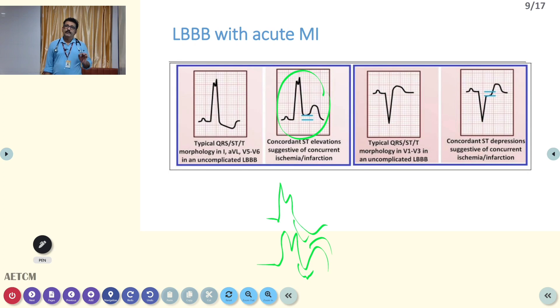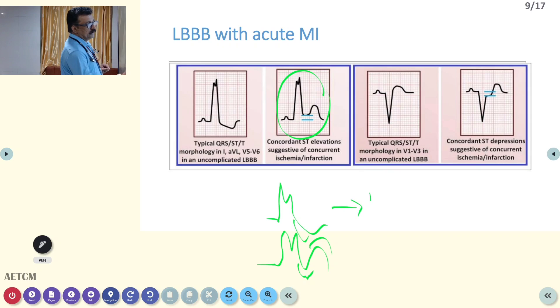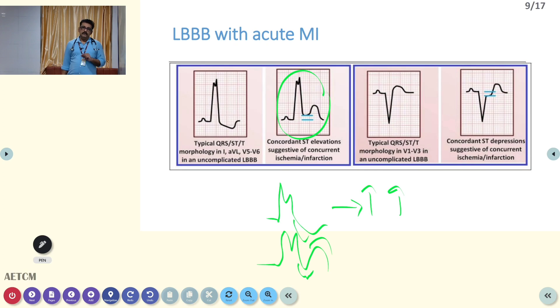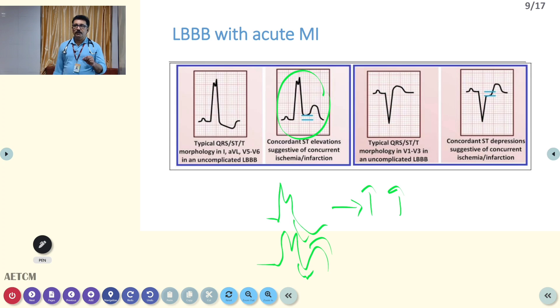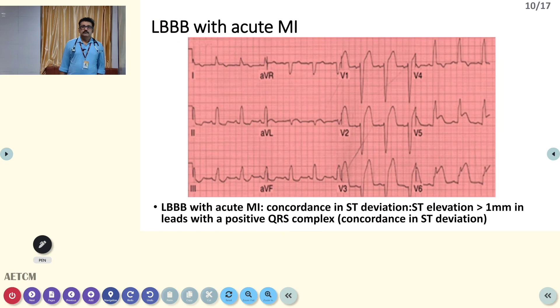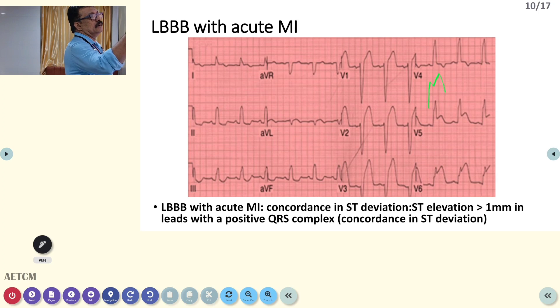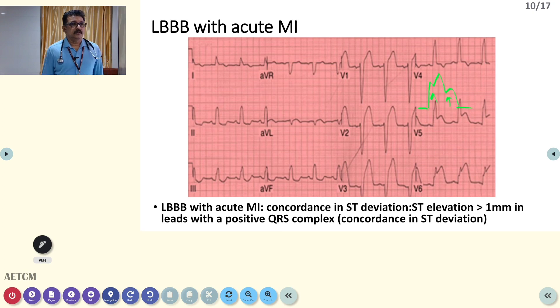If you have LBBB, always check the cardiac enzymes. If cardiac enzymes are highly elevated, that is a feature of myocardial infarction. Cardiac enzymes are the blood investigation that will tell you whether the patient is having unstable angina or myocardial infarction. If cardiac enzymes are not elevated, most findings are due to ischemia only; if elevated, it is infarction. In LBBB with myocardial infarction: wide QRS complex, M pattern with elevated ST — that is concordance indicating myocardial infarction.